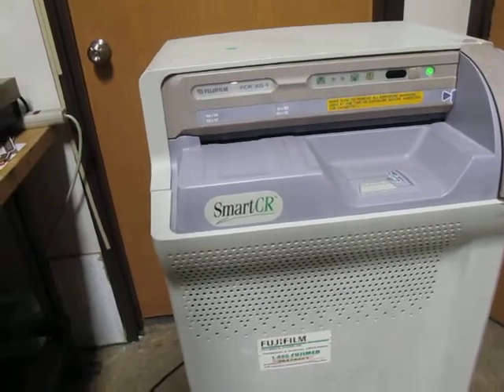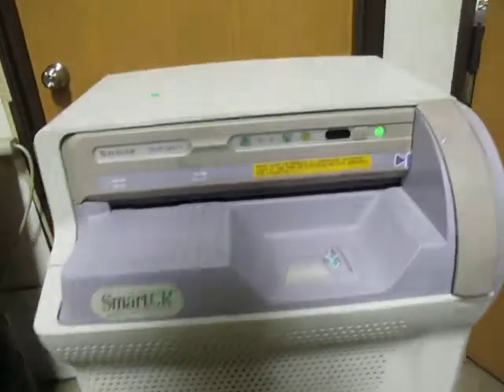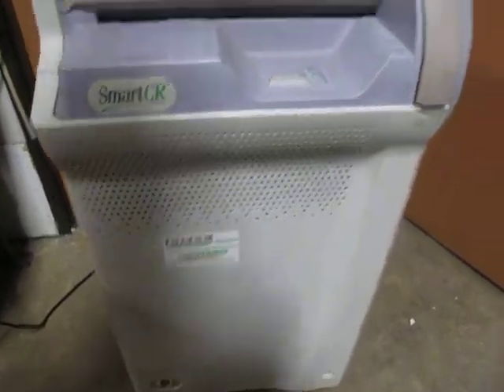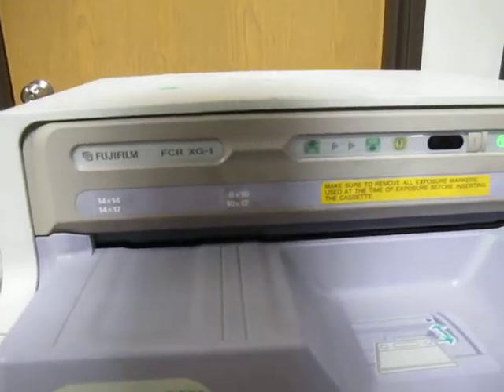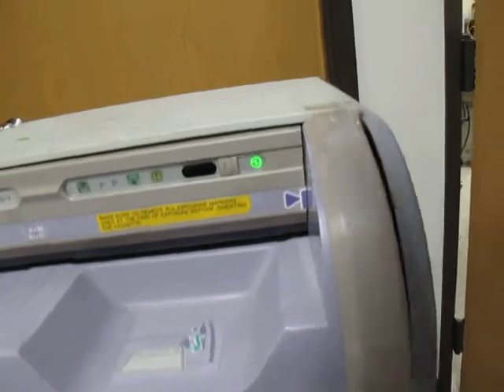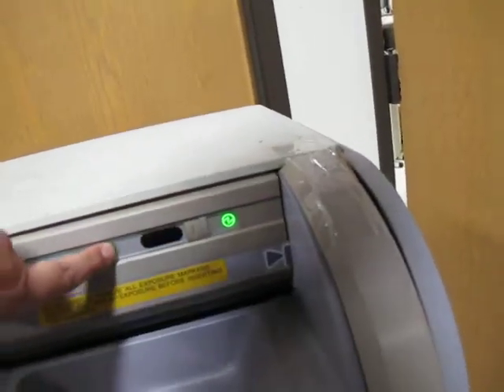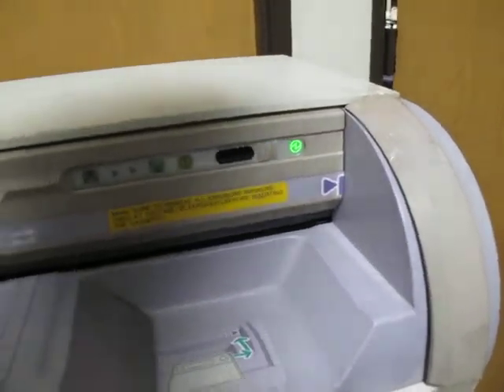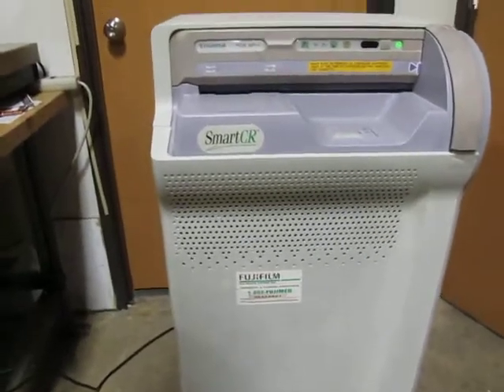Doesn't do a whole lot. Looks like you need a cassette. Something clicked, and here's this door. I don't have any cartridges, which I think is what it's waiting for.